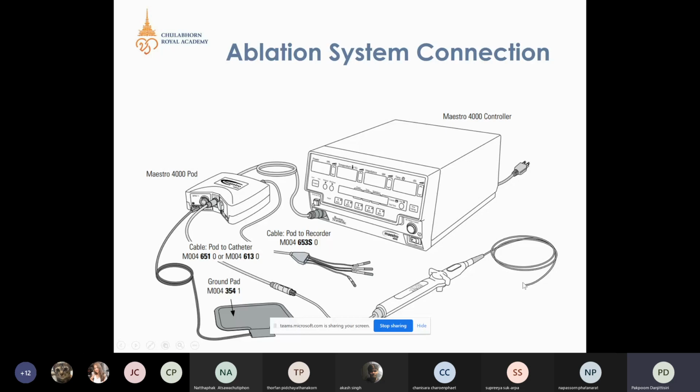After the electrical signal from the heart gets through the ablation catheter over here, just follow my arrow on the screen. After the electrical activation comes through here, it will be connected with the ablation cables over here, and then connected to this port, right? The electrical activity at this time is here, and after that you want to connect to the amplifier. You are going to have to make a connection pathway to the amplifier.